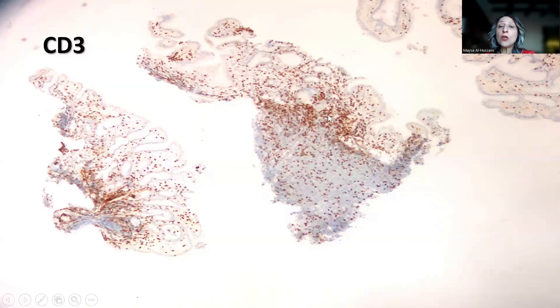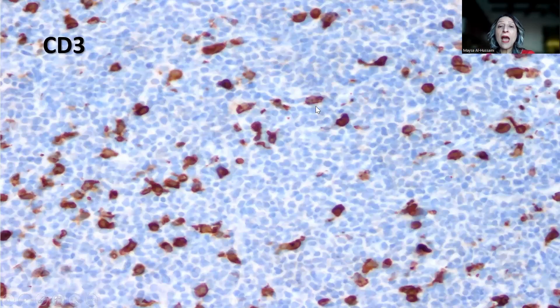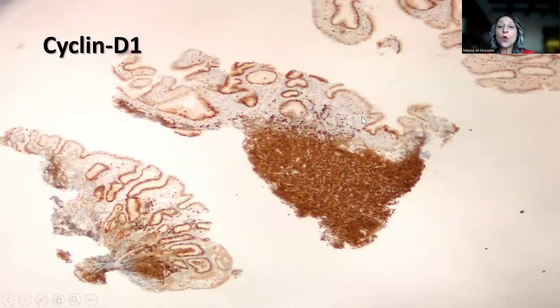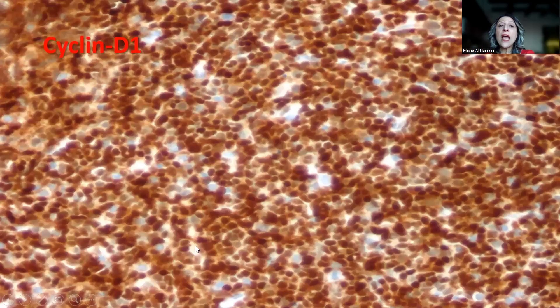This is the CD3, where we have only scattered CD3-positive reactive T lymphocytes. And this is the cyclin D1, again showing the exact same distribution of the positivity. On high power magnification, cyclin D1 was positive in the CD20-positive tumor cells.